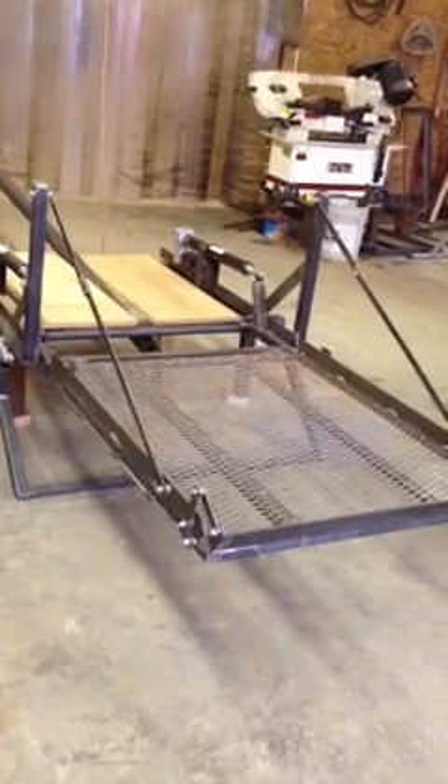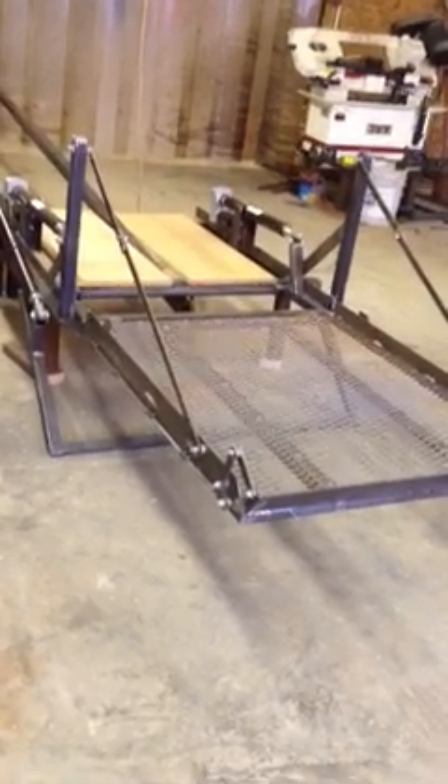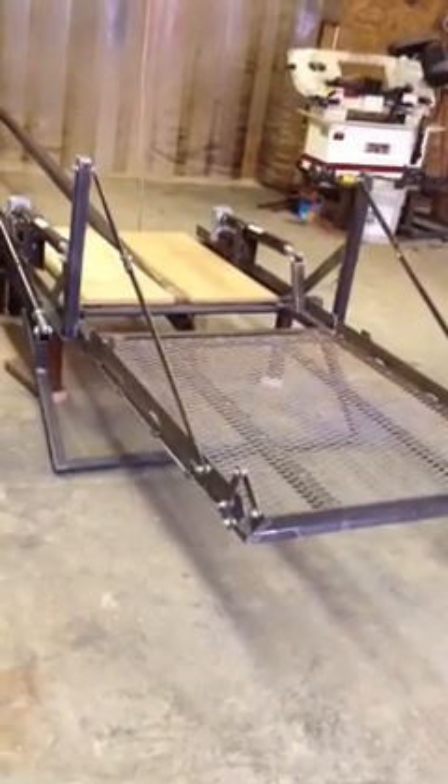The actuators we've got on this right now are geared pretty slow, which gives more power. But they've got so much more power than you need that they could actually be geared faster. We've got everything where it works real slow and smooth right now.